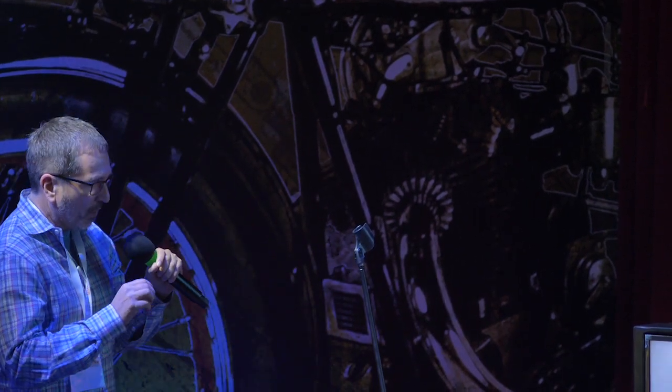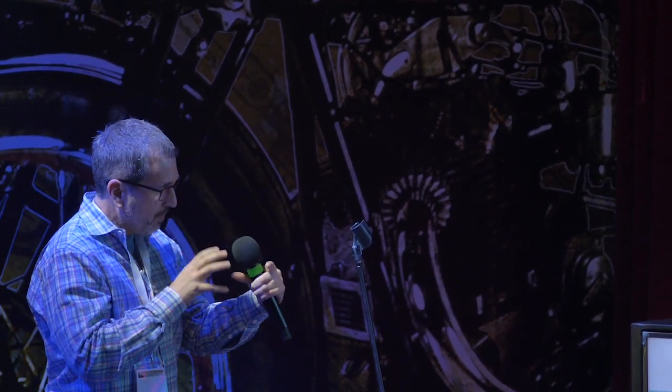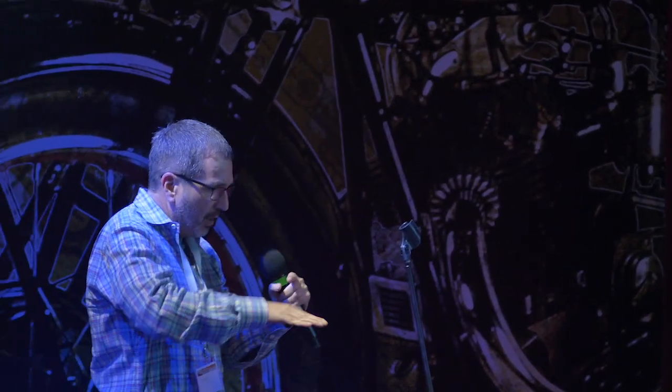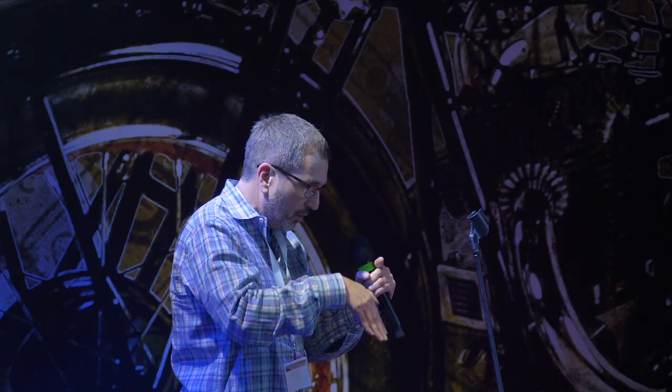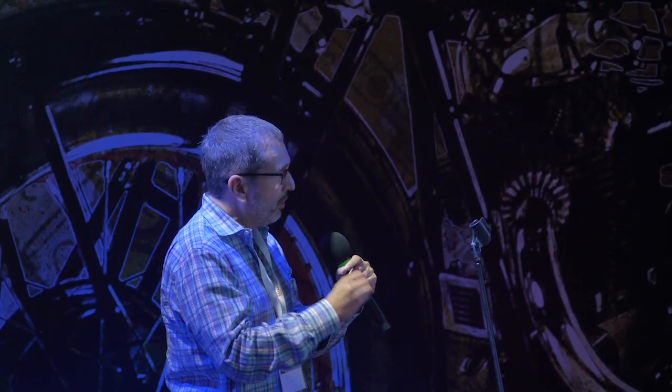Hi, Alberto. Thank you for the presentation. It's great. A technical question. When you have a big nodule and you puncture and start doing the radiofrequency ablation like a fan, sometimes the nodule is big. Is it possible that it's better to do two punctures and do the same fan instead of one? Because when you put the puncture and start ablating, sometimes the tissue gets very hard and you cannot move the needle freely.